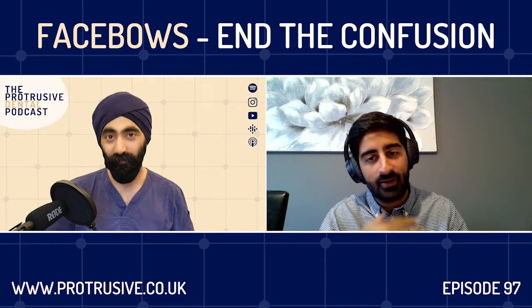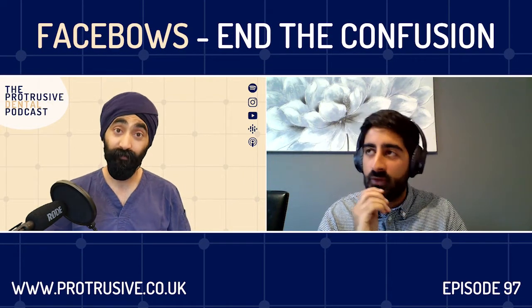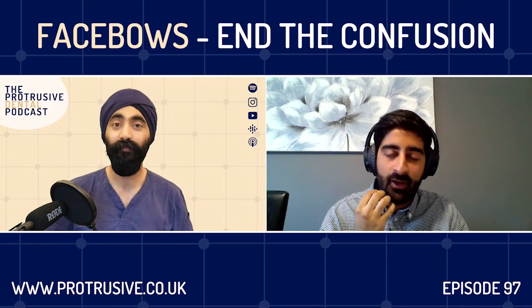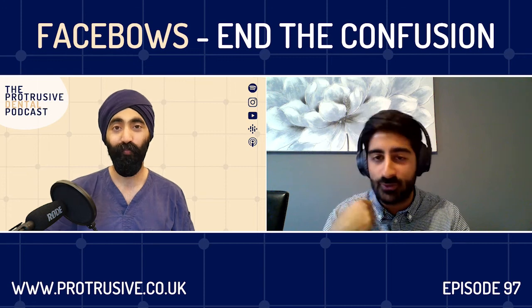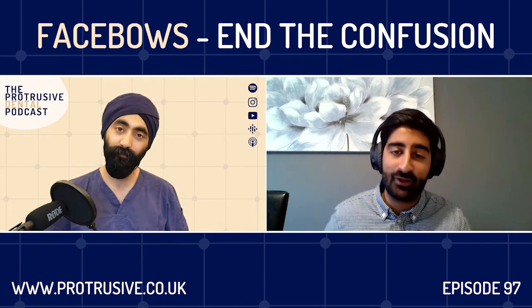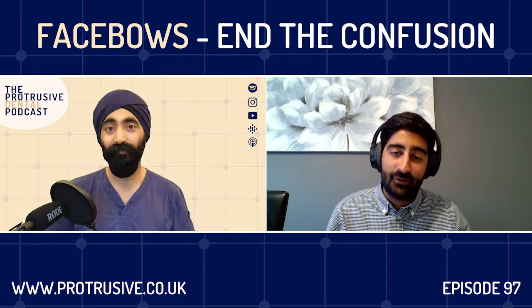Digital is definitely going to be the way to go in the future, because once we can replicate the mandibular movements properly, we don't need to worry about this jaw joint position, because we just need to know how the teeth move in relation to each other, and then it kind of goes out the window. And I think that will be how it is in the future. And we're just all waiting for it to happen.